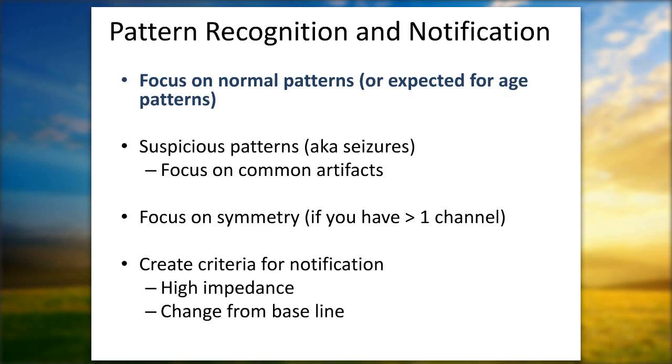Oh, sorry, I'm seeing here, the questions were down. What do I think of the subclassification of discontinuous low and discontinuous high? It's usually used for the preterms. This is correct, absolutely. So I apologize, I see now that these were just not scrolling.